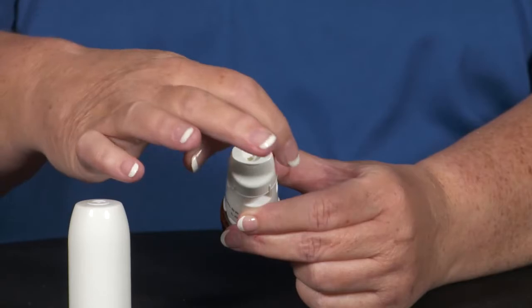After exhaling away from the device, hold the inhaler horizontally or parallel to the floor. Seal your lips around the mouthpiece. Do not use a spacer with the Flexhaler. Take in a forceful deep breath through your mouth until you can't breathe in anymore, just like this. Move the device away from your mouth.